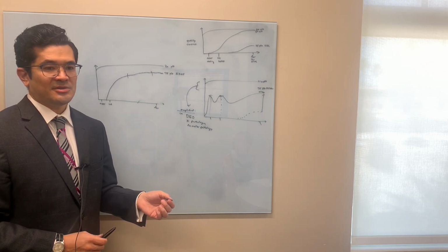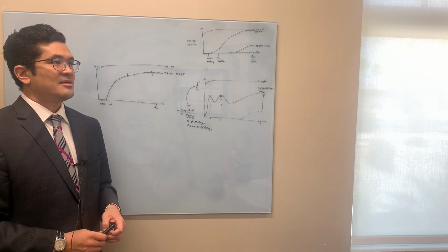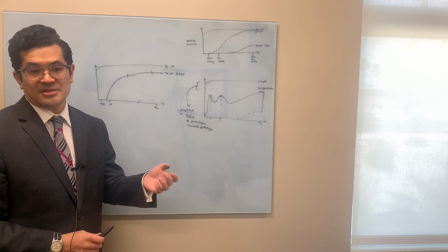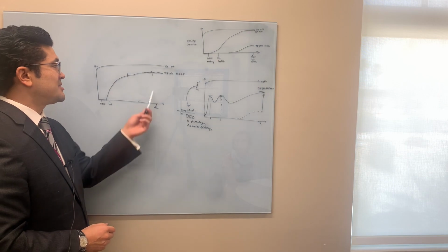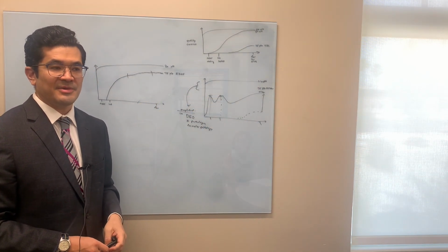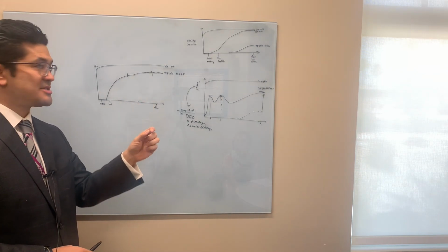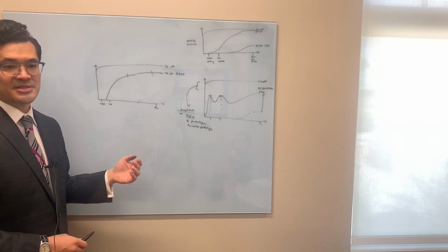The 50-year-old pilot, definitely the priority is quality contrast, right? That's the priority. You may not want to do an EDOF or multifocal. You may want to talk to them about that because there is a slight drop in quality, a slight drop in contrast. To stretch that focus longer, we're going to lose some of our contrast.